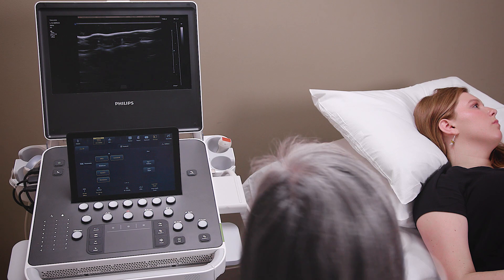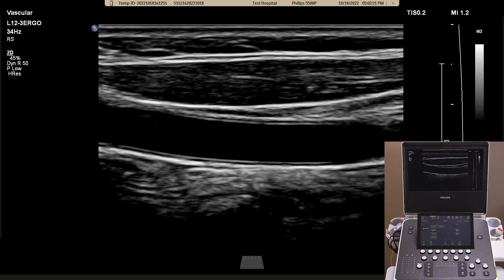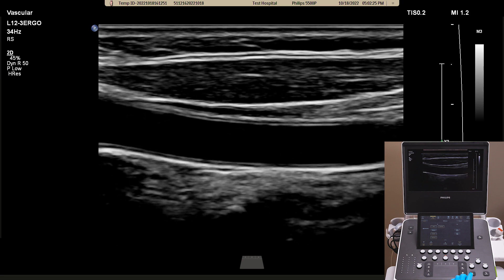Set. Place the probe on the patient's skin. Should you require an adjustment of the image due to different body habitus, all you need to do is press iScan.